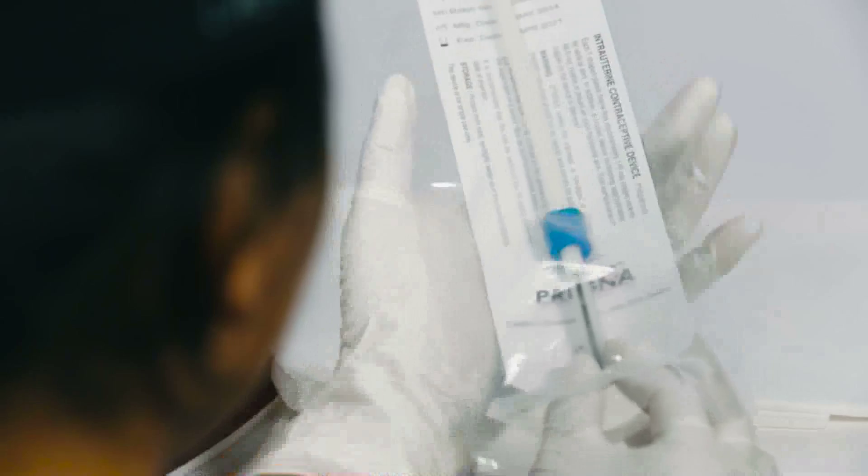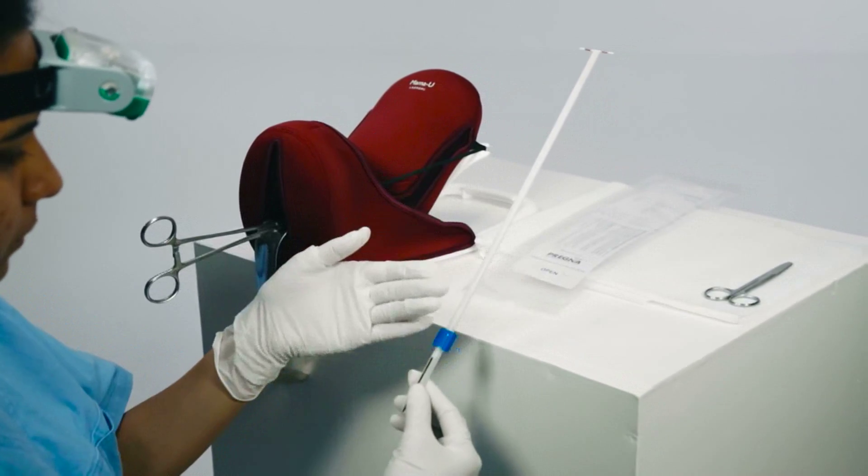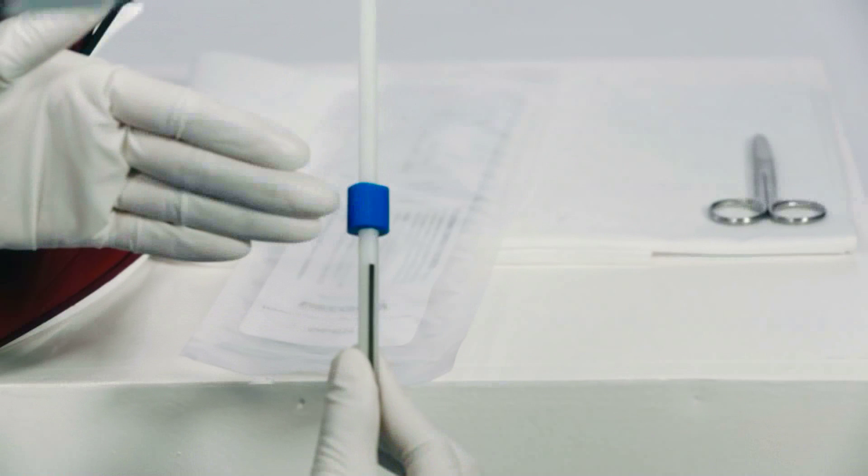Open the PP-IUD inserter. Make sure that the arms of the IUD are perpendicular to the blue flange and the black line.